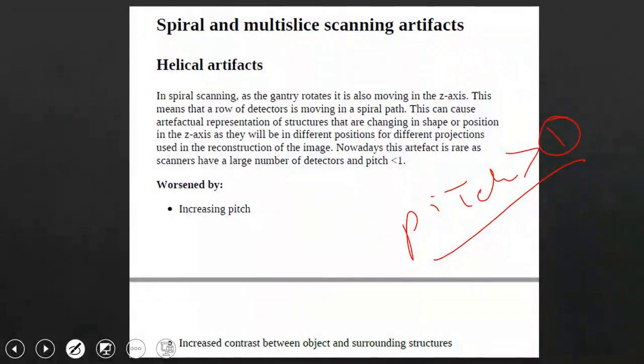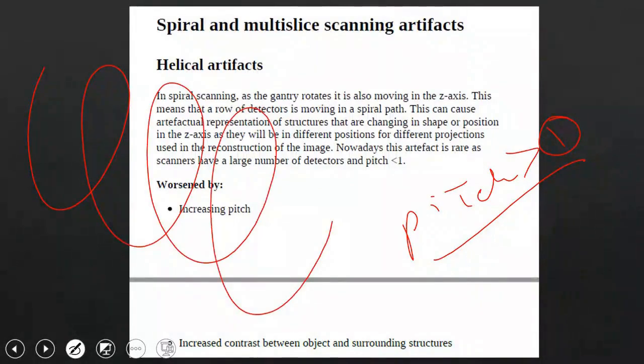You might ask, what about interpolation? Well, keep in mind that it doesn't improve. It just processes. The data present on the topic of interpolation means that when you take an image in this way, there is a part of the data that is fixed, which we can say is captured from a single point. So, what does this part do? This part performs interpolation. It starts to look at the part that comes after it and the part that comes before it, and it begins to estimate the values or enhance the image quality that exists.